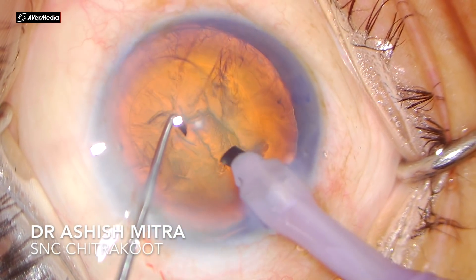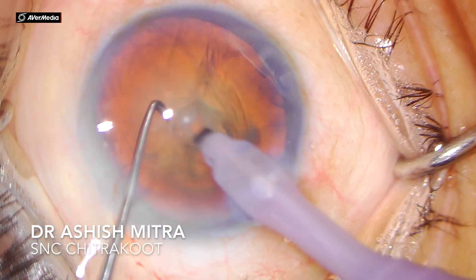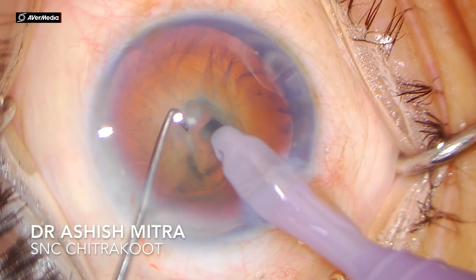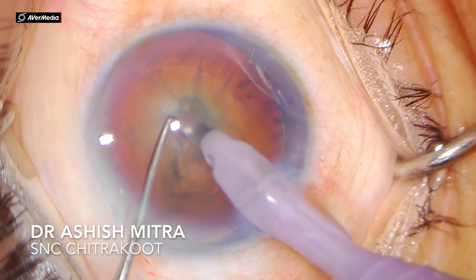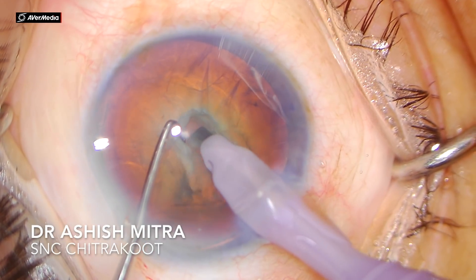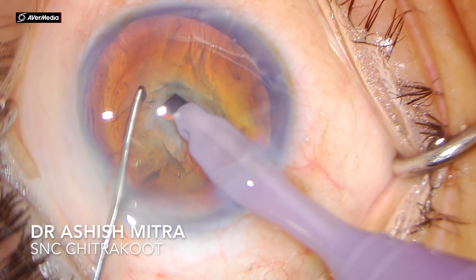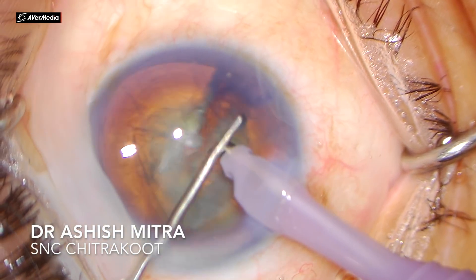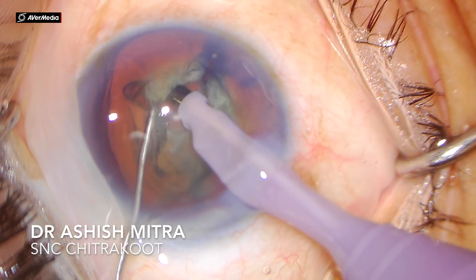You have to make a small and deep trench — small so that you have ample lens material in front to hold. I am making this trench, but it is not too long; it is short and deep so that the red glow is visible from behind. As you can see, the tunnel is small and deep and you can appreciate the glow. You now have ample lens material in front to hold.